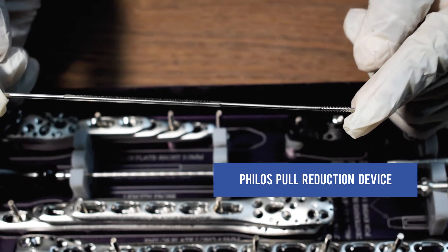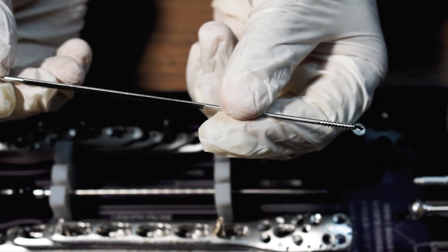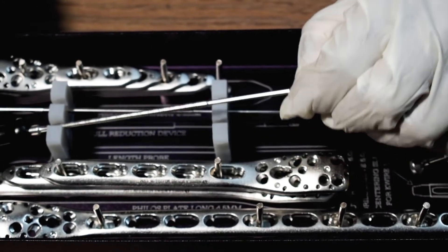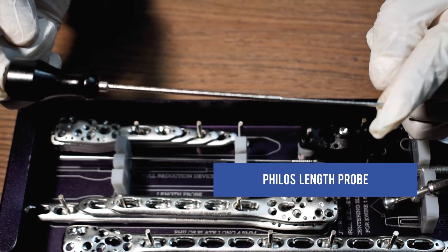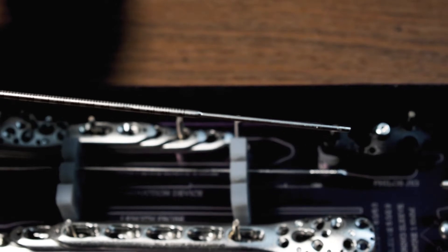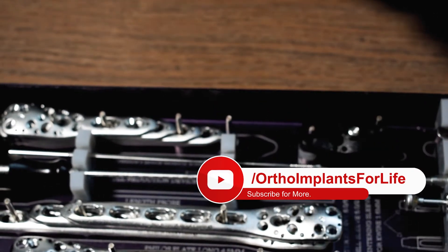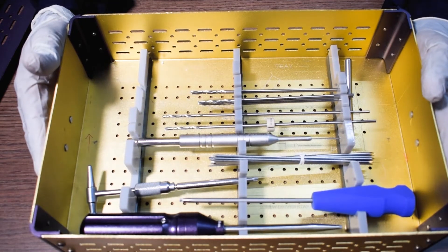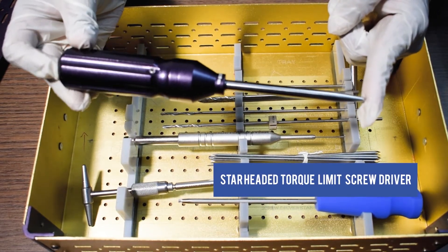This is the PHILOS Pull Reduction Device. This is the PHILOS Length Probe, PHILOS Tray 2.8mm, and the Star Headed 3.5mm Torque Limit Screw Driver.